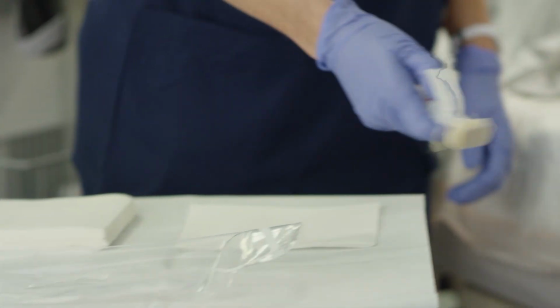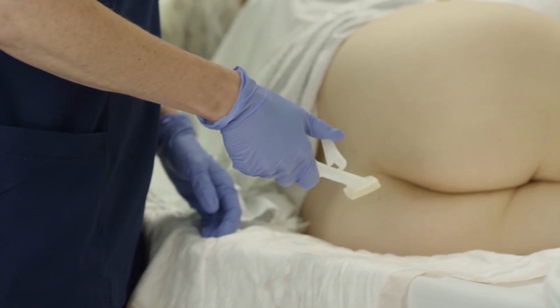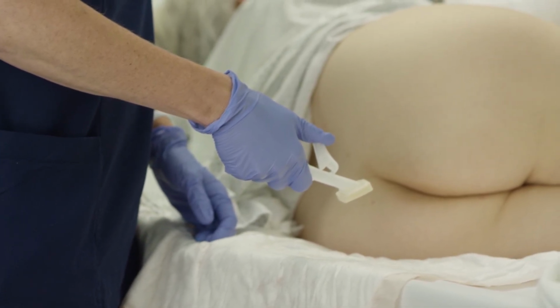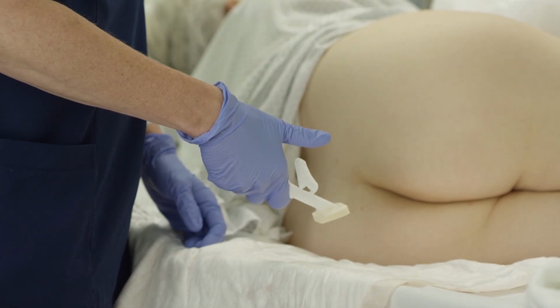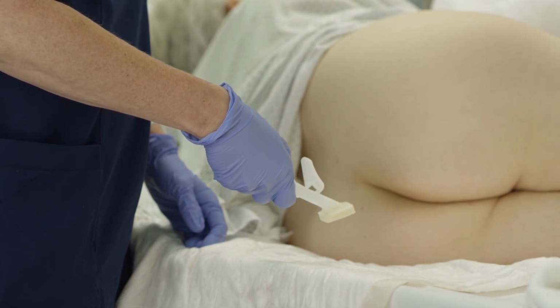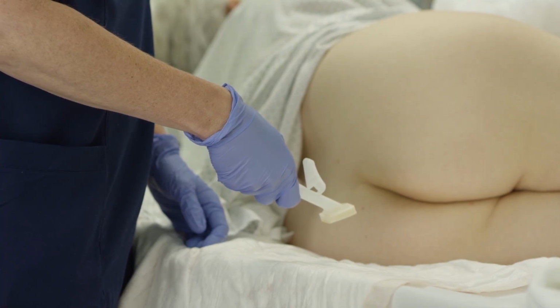Pick up and grasp the applicator and place your thumb at the end of the lever. While aiming the sponge end of the applicator downward, firmly depress the lever to break the internal ampule. You will hear a snapping or popping noise when the ampule breaks.